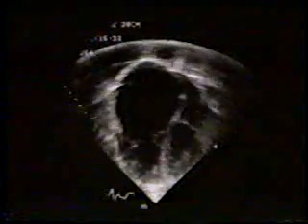Left-sided chambers were of normal dimension. In real time, observe the characteristic abnormality of a dysplastic tricuspid valve resulting in severe tricuspid regurgitation. Color flow examination confirmed the presence of severe tricuspid regurgitation and the atrial septal patch was intact. You can see this vividly in real time now.